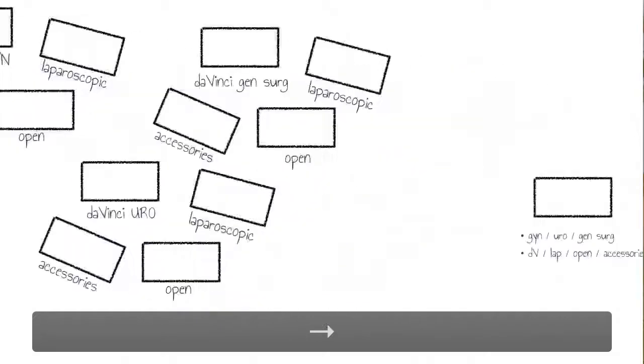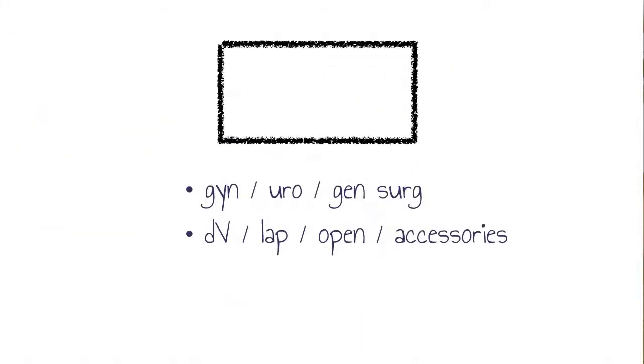In our ORs, we actually have one tray for daVinci, lap, open, and accessories. All that stuff is in there. And for any daVinci case that's being done by a gynecologist, a urologist, a general surgeon, a bariatric surgeon, a gynecologic oncologist, doesn't matter, this one tray has everything in it. And this improves not just the efficiency of getting it set up and broken down, this also improves the efficiency of those folks that are filling it, that are putting stuff in it. If it's the same every time, they're going to get it right far more often.